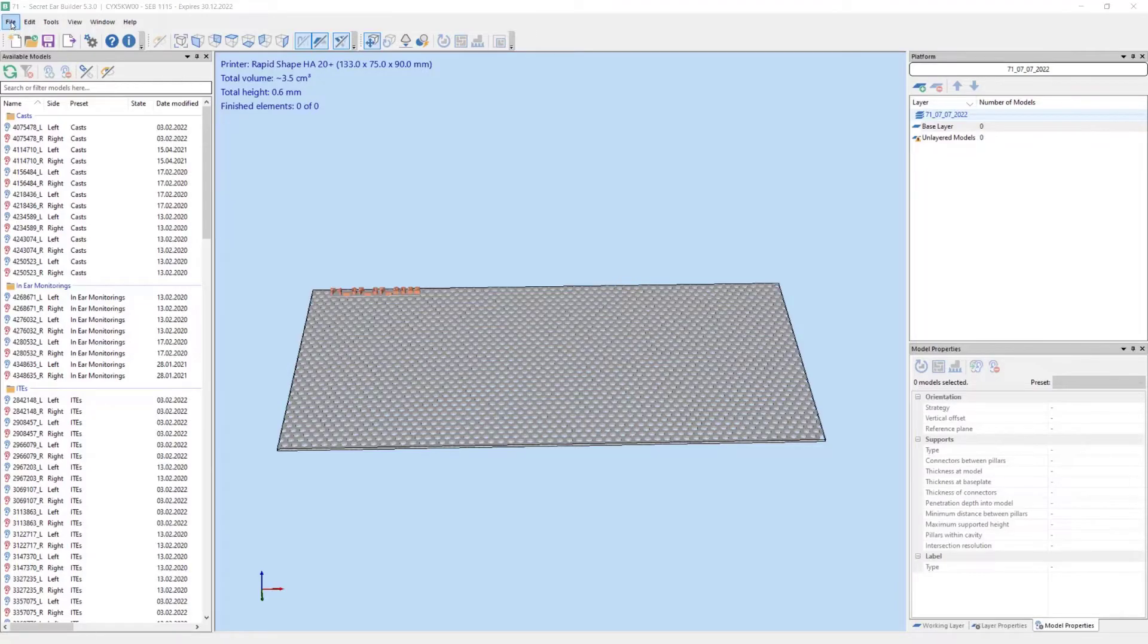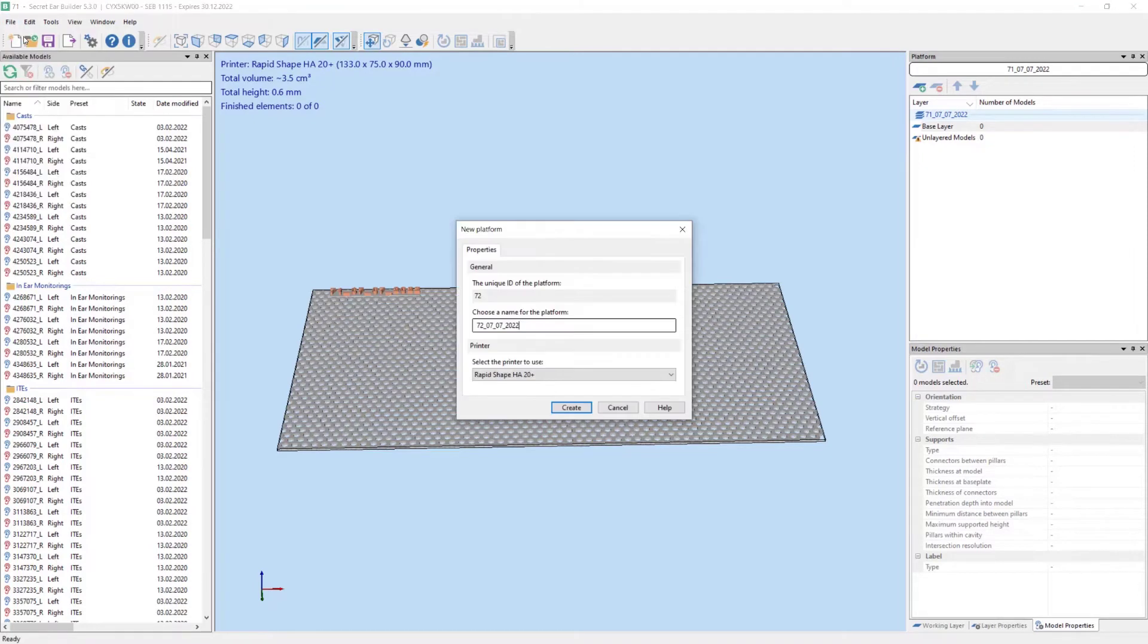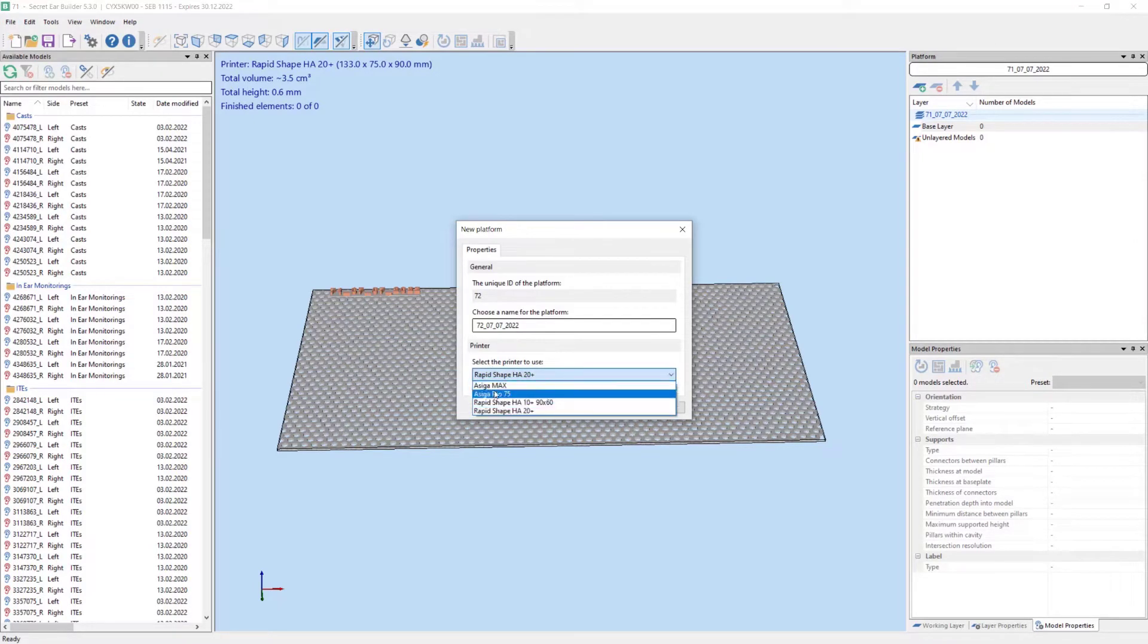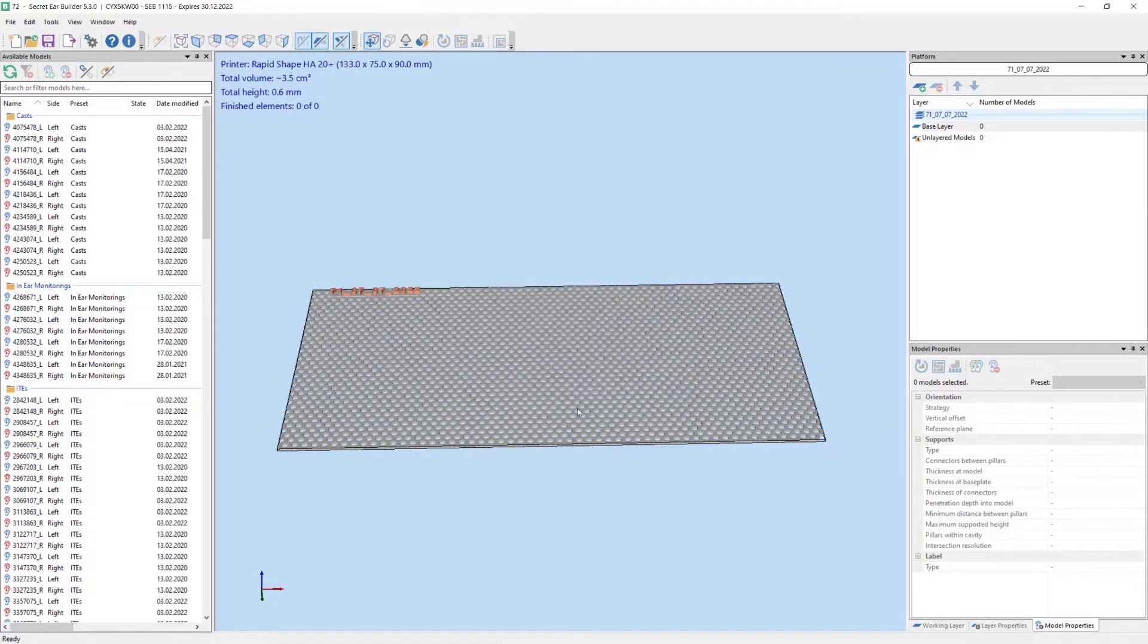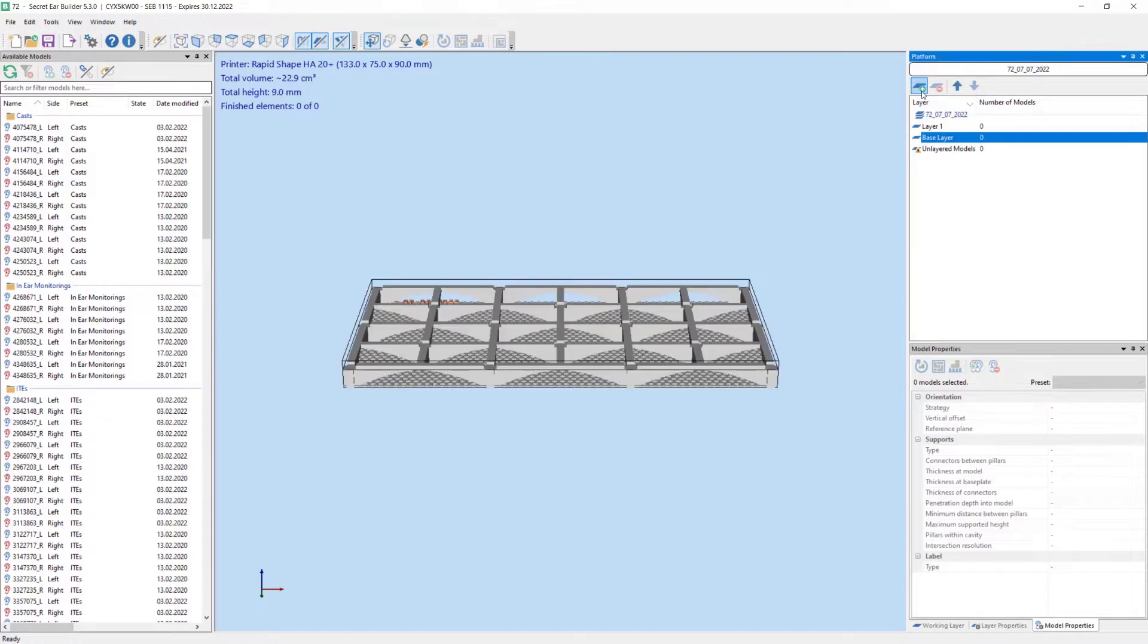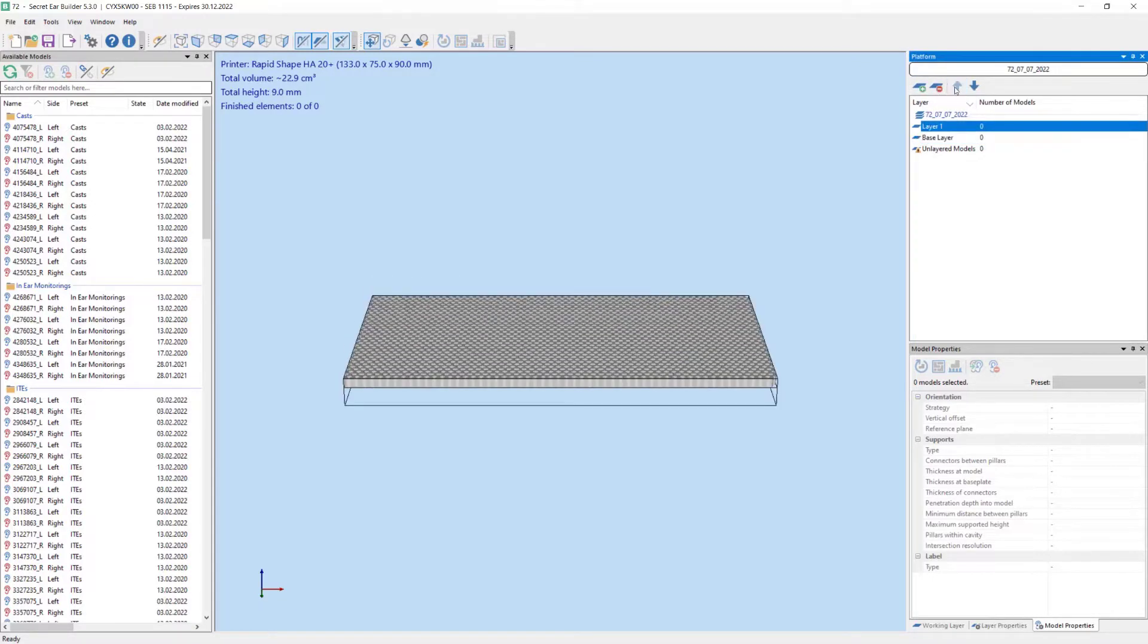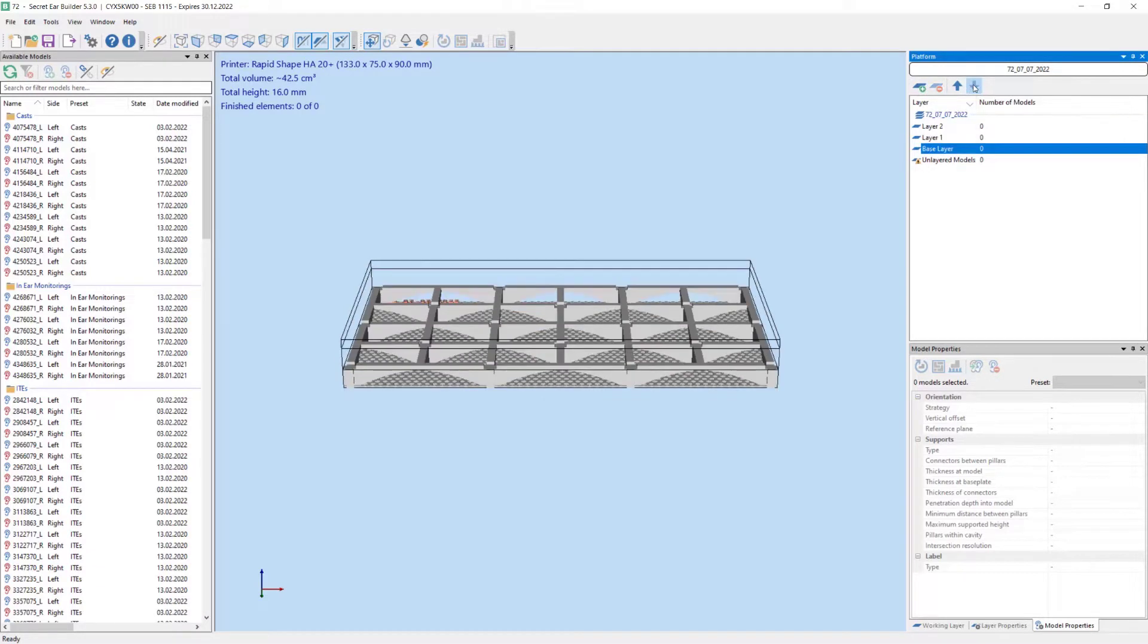New build job. Selecting the printer - Rapid Shape HA 20+. We intend to set up a print job with 3 layers. Firstly we create the layers and columns. The ear molds will be added in a second step.